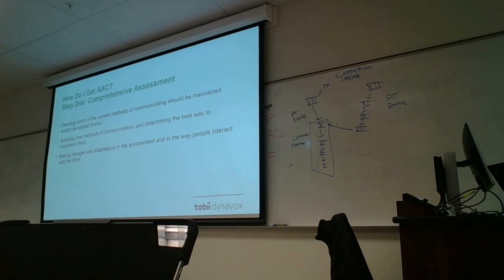But once everything is submitted, it's about 7 to 14 days before we get a response from the insurance. Once the device is approved, we get a shipment notification. They verify the shipping address, and someone has to sign for it. Then we schedule a meeting where I do the training and setup of the device with the family and the SLP. The more people there, the better, so that we're all on the same page and learning about the device.